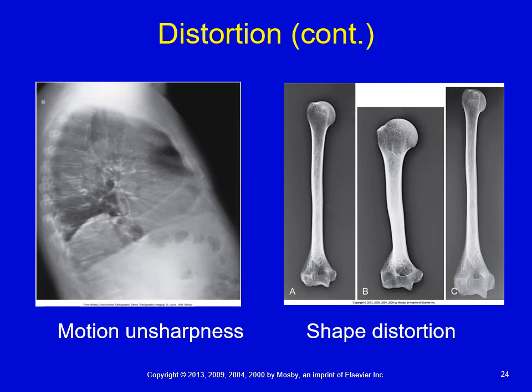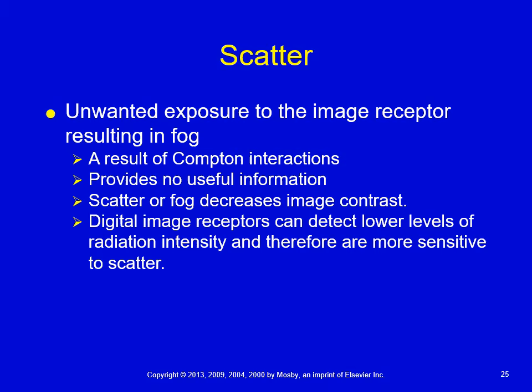So as a tech, these are some of the things that you're going to be looking at. As you get more muscle memory and get familiar with looking at images, you'll be able to clearly identify when something doesn't look right in terms of motion, in terms of shape, and also in terms of size.